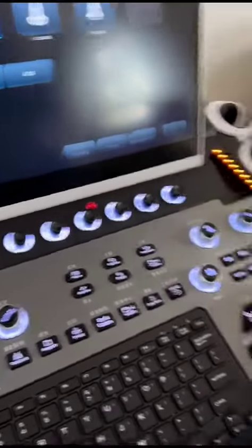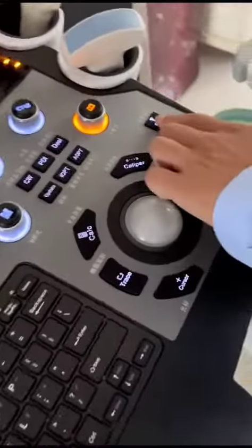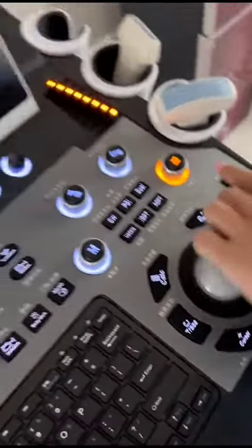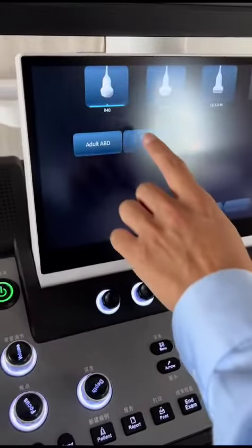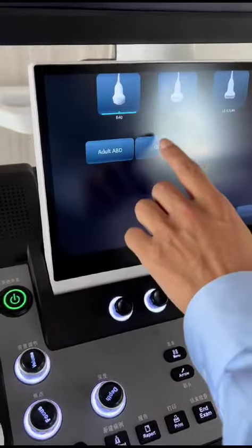Firstly, press this key EXAM and choose the 4D probe, choose OB.